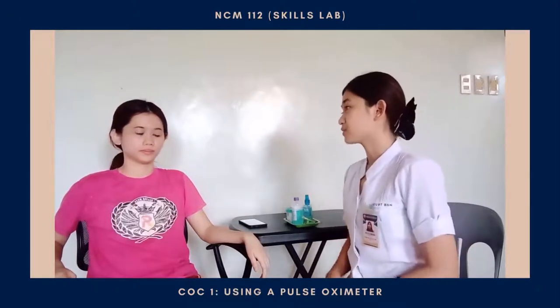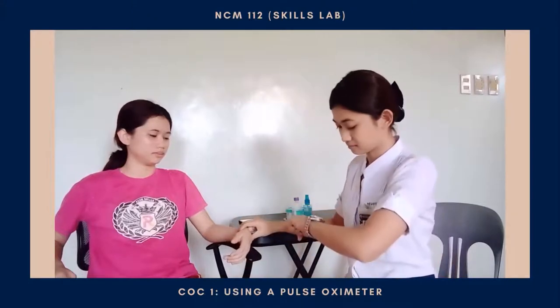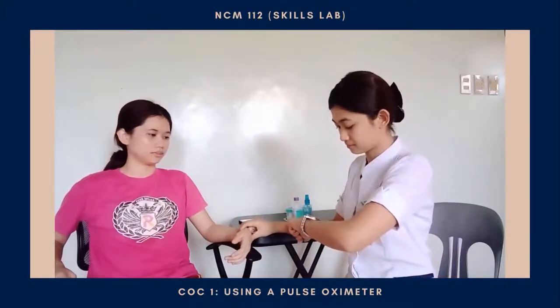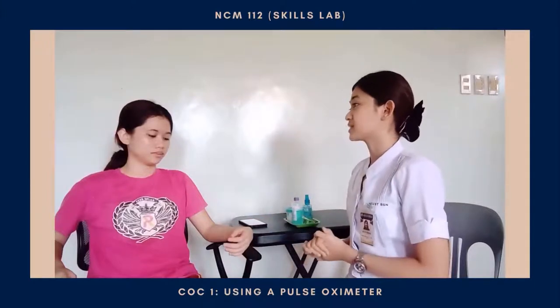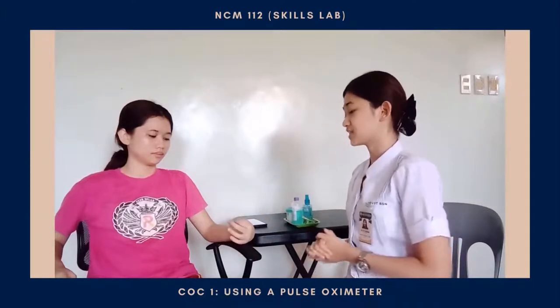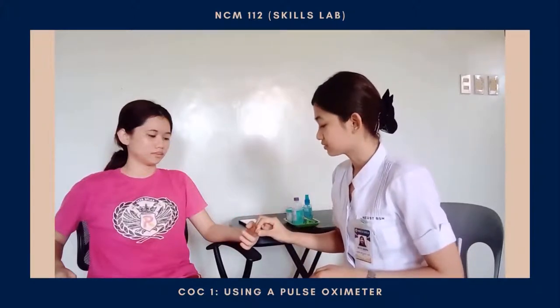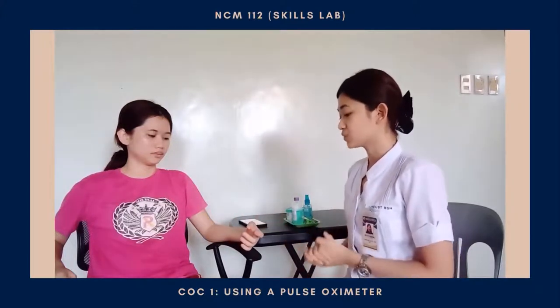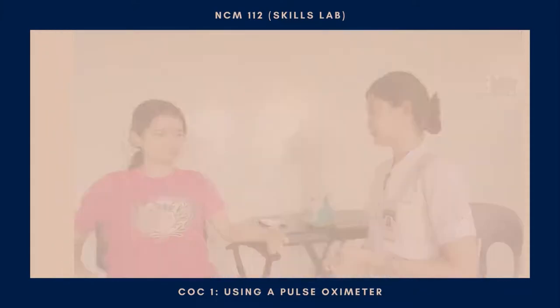So now, ma'am, I will proceed in checking your pulse. Okay, your pulse rate is 77 beats per minute, which is within the normal range. And I will also check your capillary refill. And it is also good. This means that we can proceed in using your index finger.